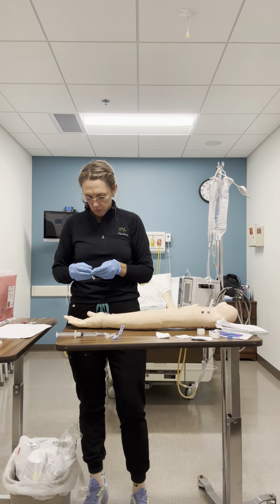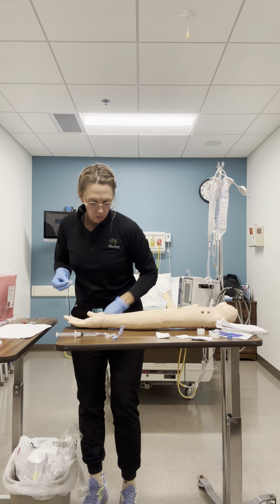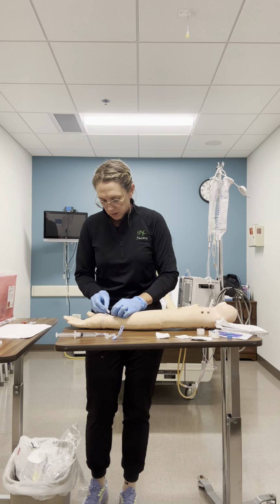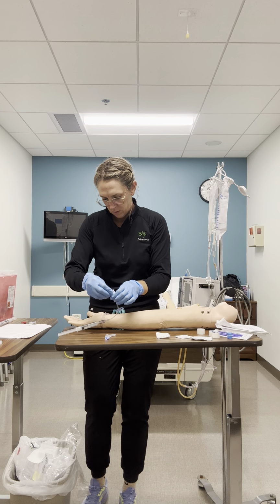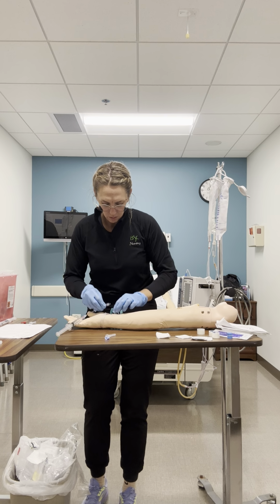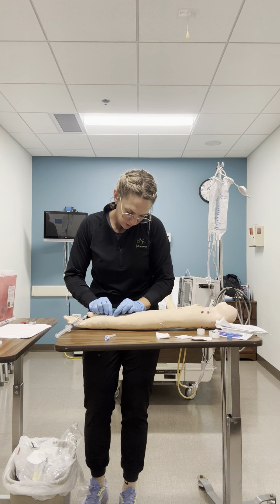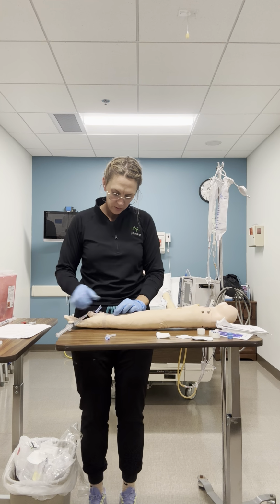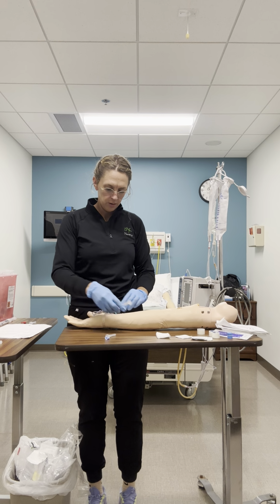I'm going to clean with my alcohol. I'm going to connect. I'm going to open and flush.